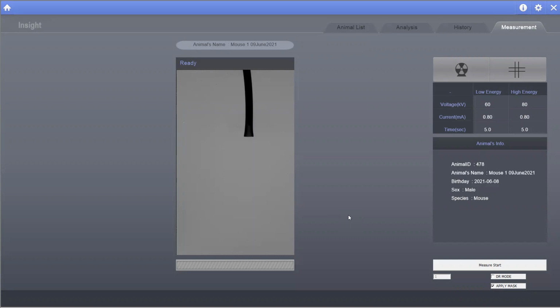So another question is, can you see a tumor and measure the size of it? So you would be able to see a tumor on the X-ray as long as there was enough difference between the tumor and the tissue around it. On the system itself, the ROIs are, I have to look in to see if you can measure it on there. You could export the image as a TIFF or a JPEG and then import it into other third-party software and do the measurements there. They are 2-dimensional X-ray images, so it would be a 2-dimensional measurement that you're getting based on the size.